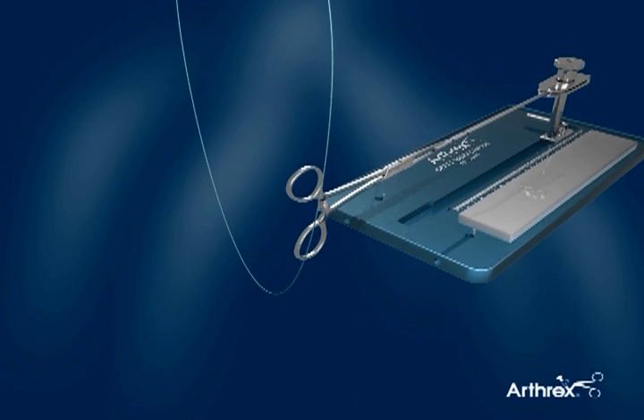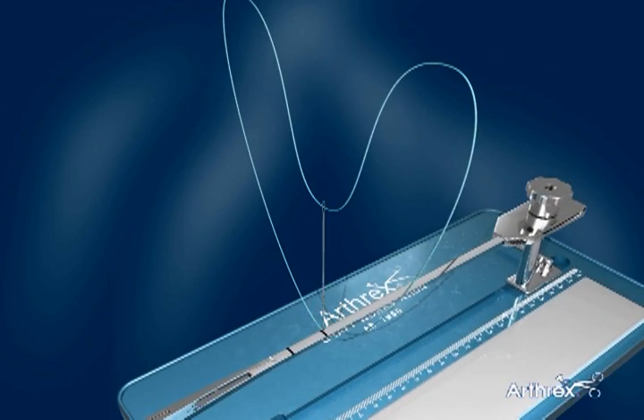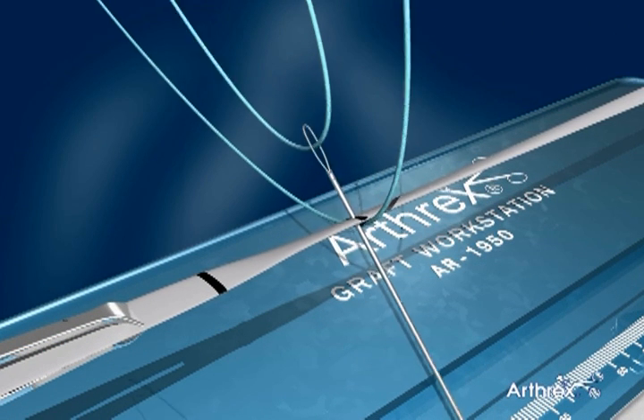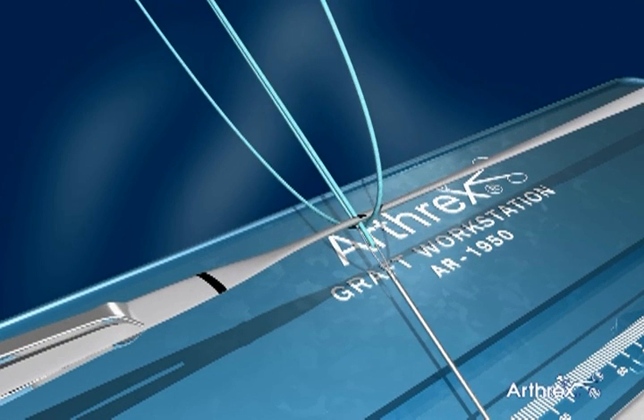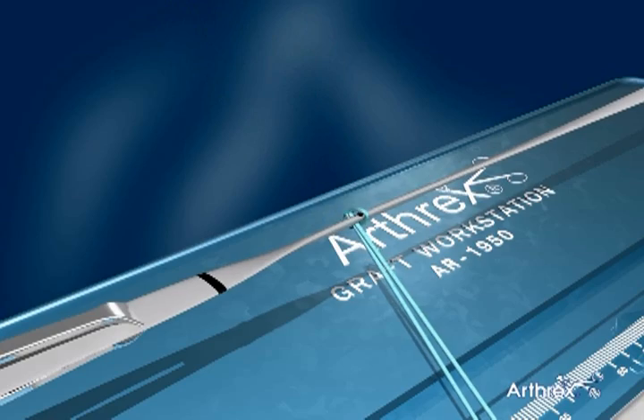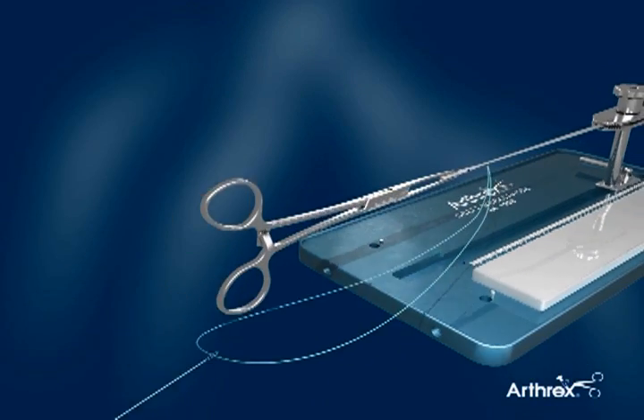The critical first step involves dropping the clamp and graft through the fiber loop suture and making the first pass at the second mark. Unlike the traditional suturing methods mentioned above, the speed whip technique begins at the mark farthest away from the free end.